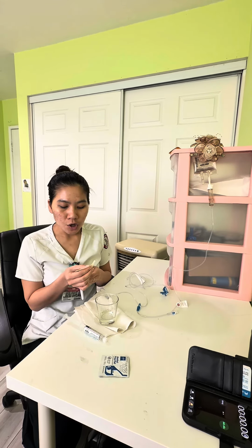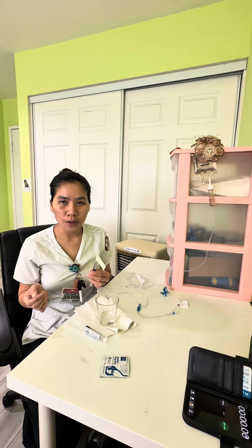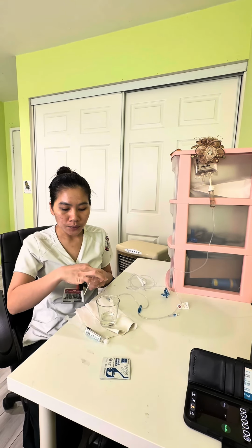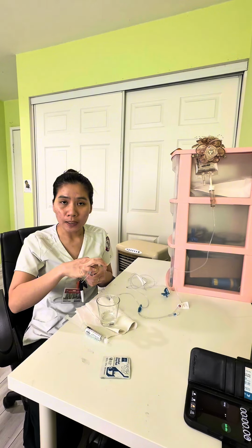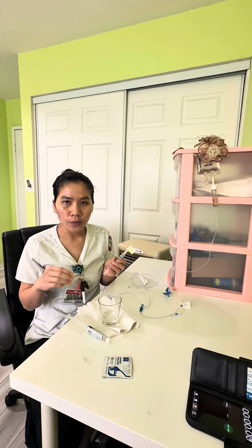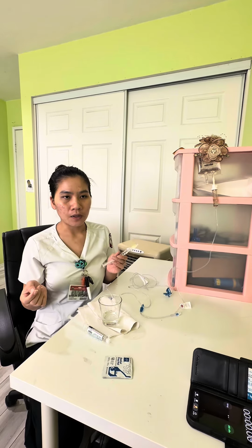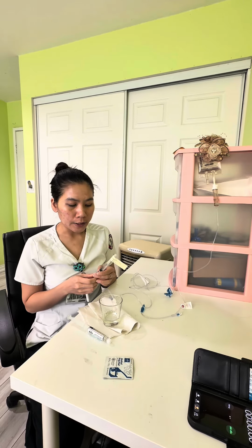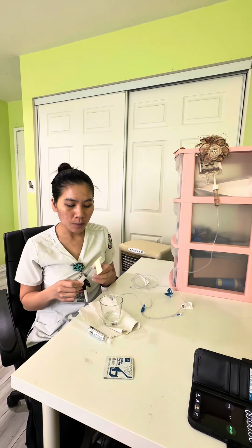For the ondansetron, 4 milligrams run over 2 minutes. The available is 2 milligrams per 1 milliliter, but I need to also dilute with the same amount of normal saline. So I have the syringe with 4 milliliters, ready to be used and also labeled.